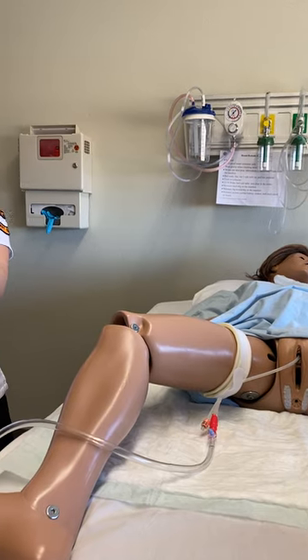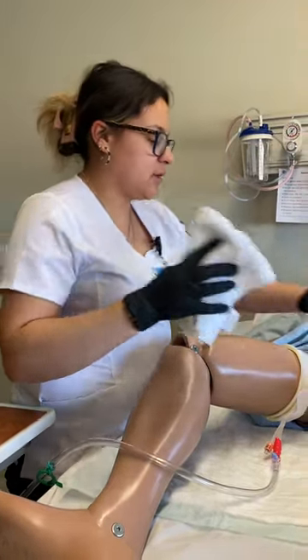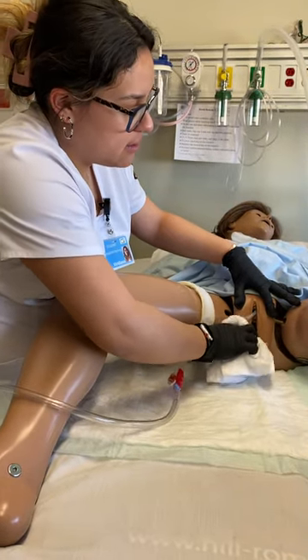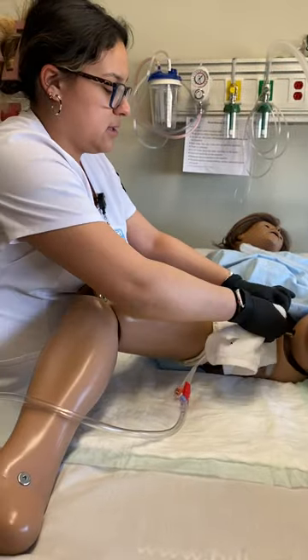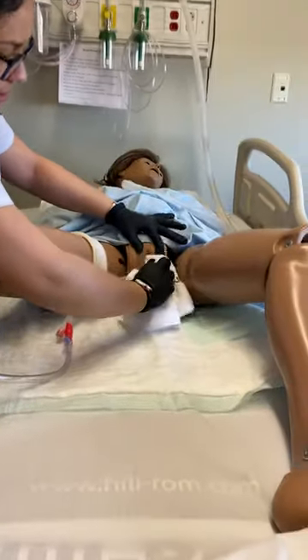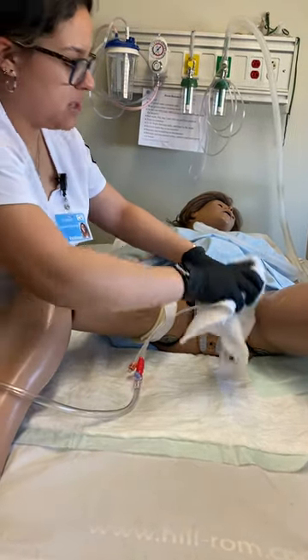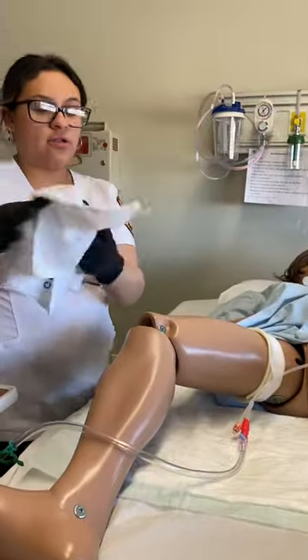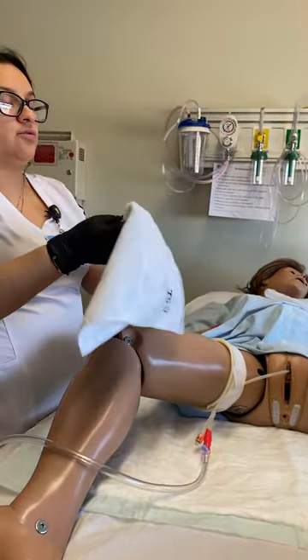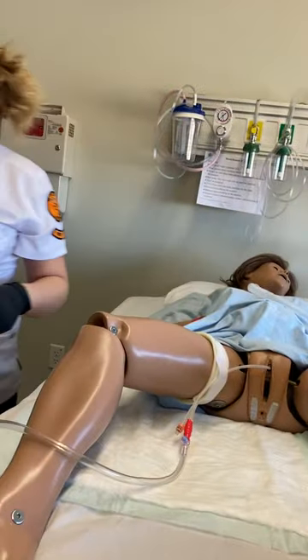I'm going to go ahead and grab another pack of wipes — these are regular Peri care wipes — and I also have a pair of dry wipes. I'm going to go ahead and dry off the peri area, pat dry. Then I'm going to grab regular Peri wipes and finish up: clean, pinch, and clean down here. I'm going to grab another towel that's dry, drying using a new side of course, and then dispose of this in the proper receptacle.